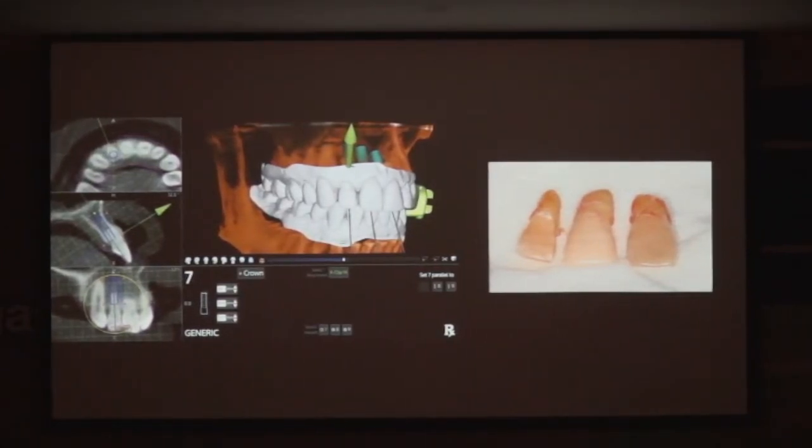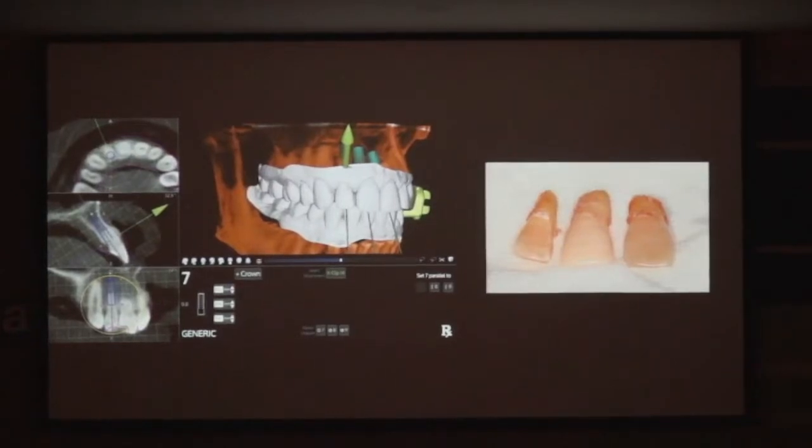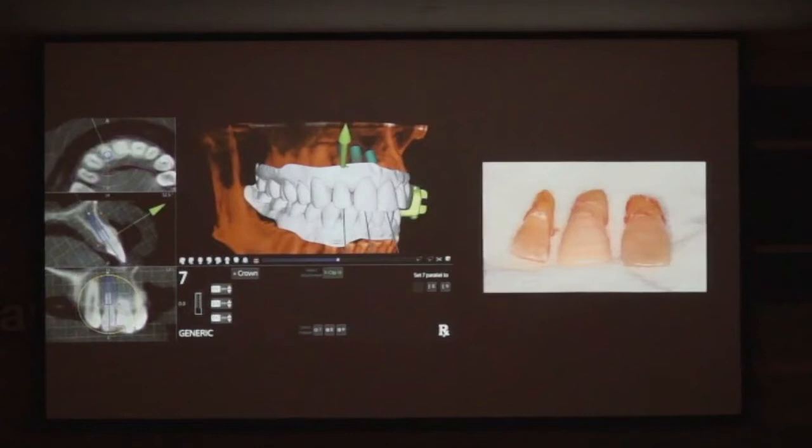Now again, people are asking me what to do as far as virtual teeth and when to use these. When I'm planning a case like this, I don't hardly need this 3D part of the CT at all, because I'm going to be using those STL files, or the intraoral scan. And if you look down at the bottom, what I was telling you before is I use these to look at emergence through the STLs, and these are the windows I really use to plan my implants.